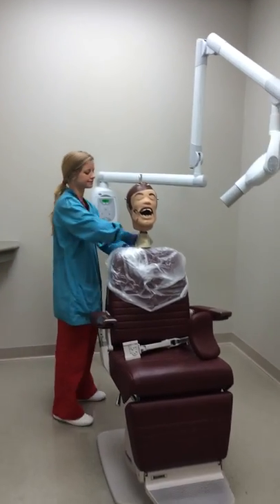To finish up, remove the patient's thyroid collar and escort them out of the room.